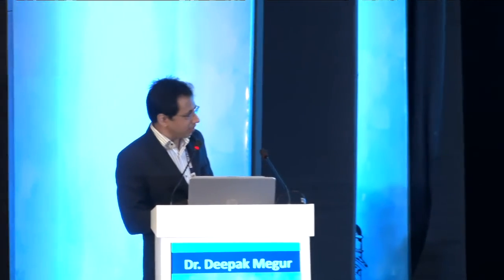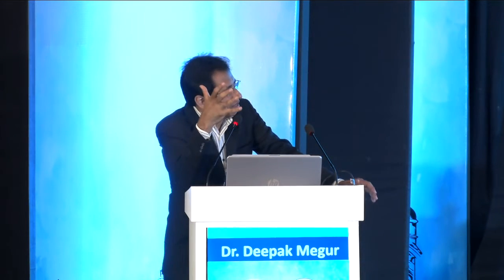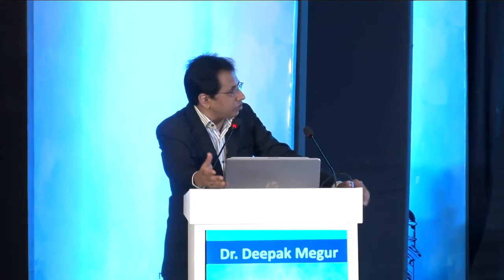Thank you, Dr. Deepak. Those are some fabulous teaching points and lovely videos. It's amazing how well you're able to capture them. We have just 5 minutes for discussion. I'd like to ask Samresh, you showed the last clip of the DMD happening while doing your side port hydration. What tip would you want to give to the delegates here to minimize that? It's a very common mistake which most of us make.